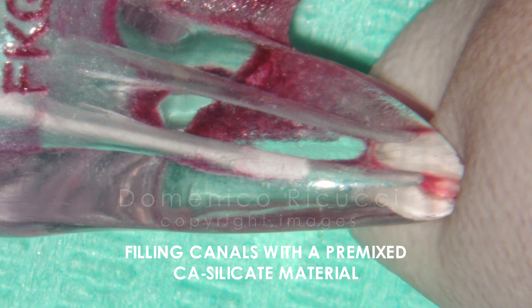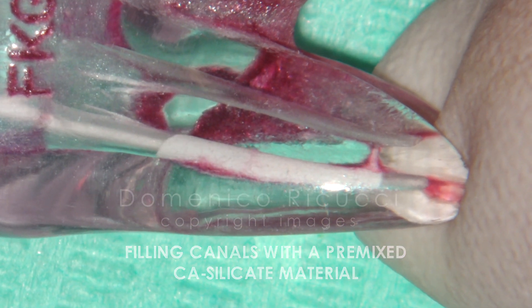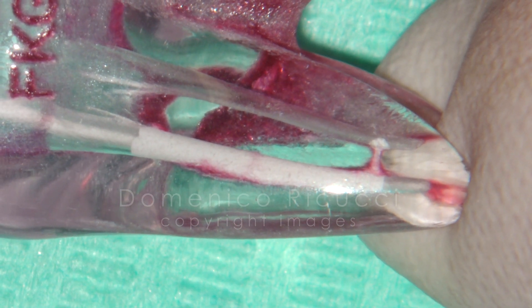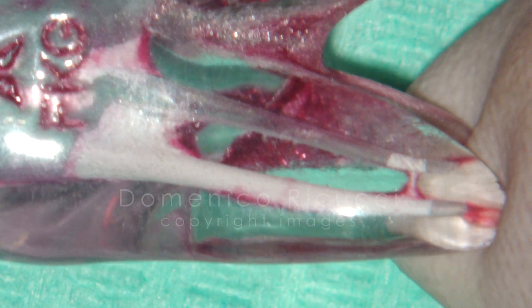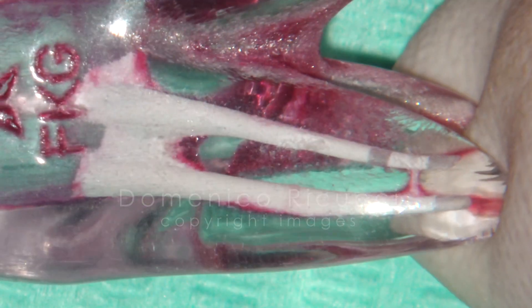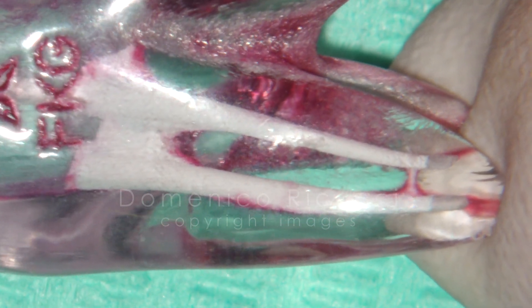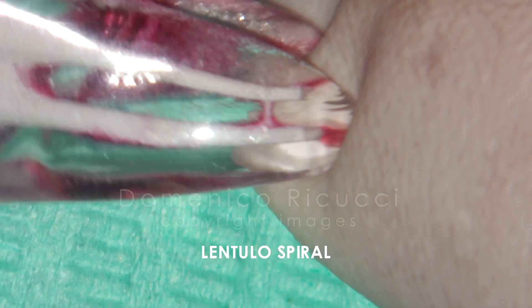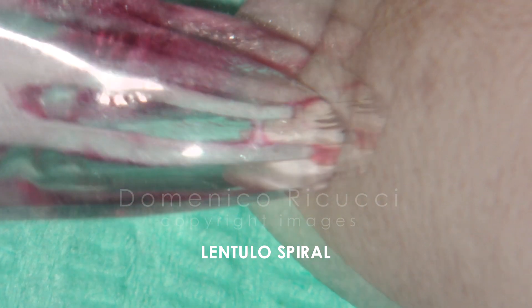Obturation with a premixed calcium silicate cement. A lentulospiral is used to assure filling of the apical portion.